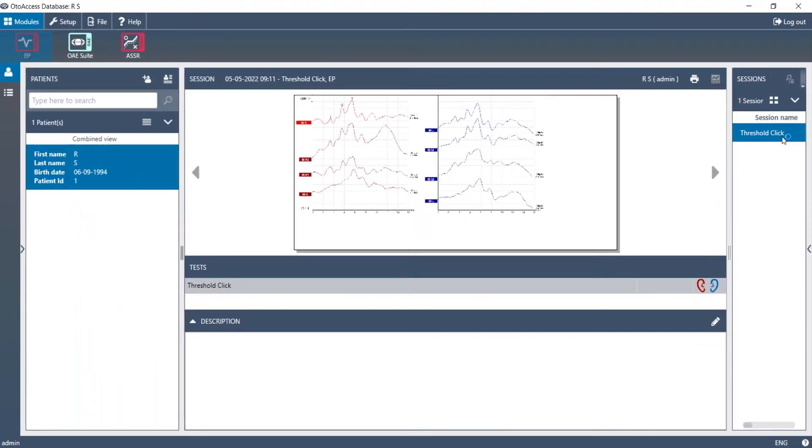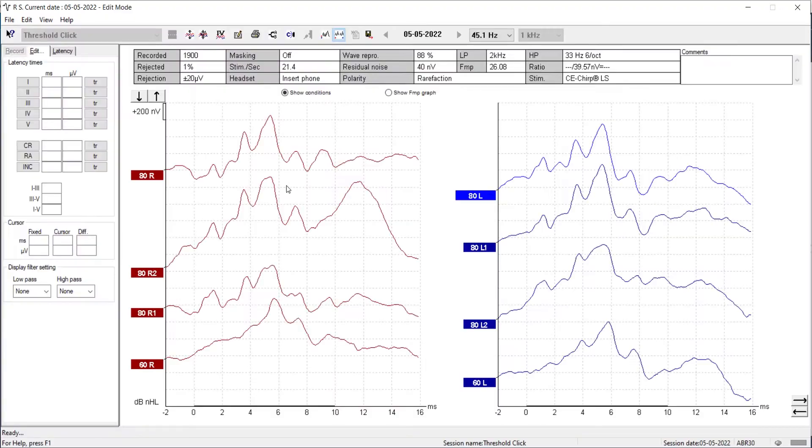The Eclipse software starts automatically. You do not need the Eclipse to be connected to the PC to do this.